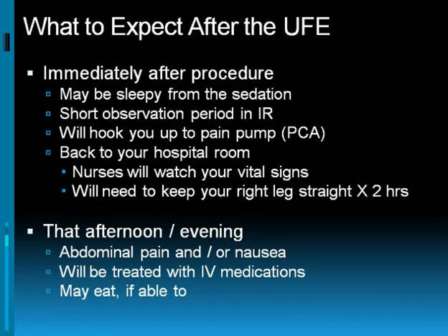You will be hooked up to what we call a PCA pump, and that stands for patient-controlled analgesia, and this is basically a pain pump. It pumps pain medication in that you control. And the big advantage to this is that if you are in pain and you want some pain medication, you can pretty much control it. You don't have to wait for a nurse who might be busy with other patients in the middle of the night, for example. The PCAs are very safe. They do have lockouts, so you can't accidentally overdose yourself.